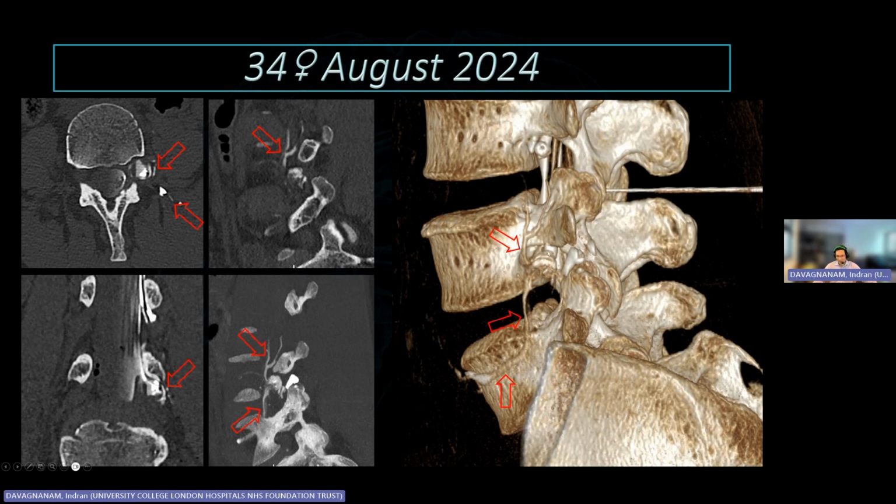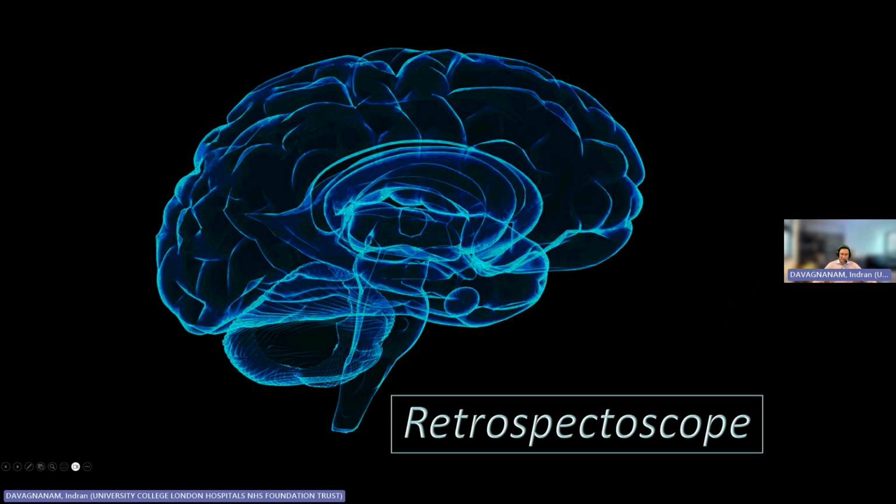I've done some fancy reconstructions here just to show that. So you can see the needle that's been put in, the meningeal diverticulum there, and then the filling of the veins on either side. Just to illustrate the point, these things can be unexpected in terms of presentation, in terms of number, in terms of how they actually leak. So you have to preempt these things, not go in with a set of expectations. Everything's really quite fluid, so to speak, forgive the pun.